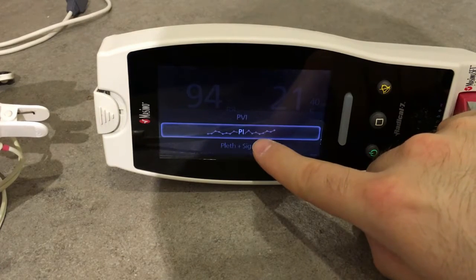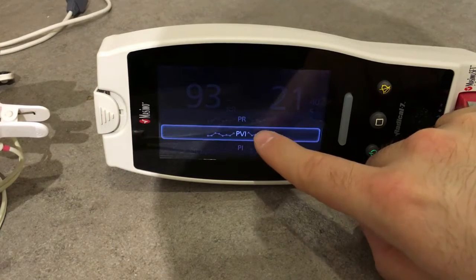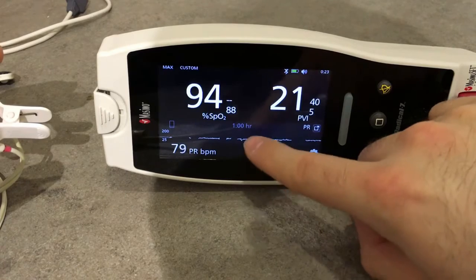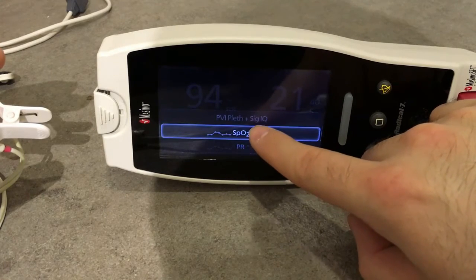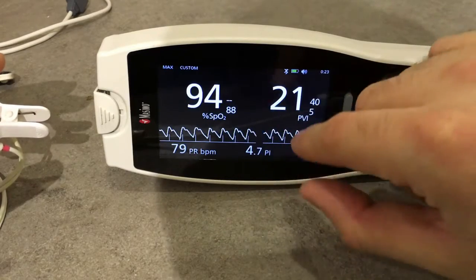We can also display pulse index trend, pulse rate, pulse rate trend, and SPO2 trend. We can really customize everything on this screen.